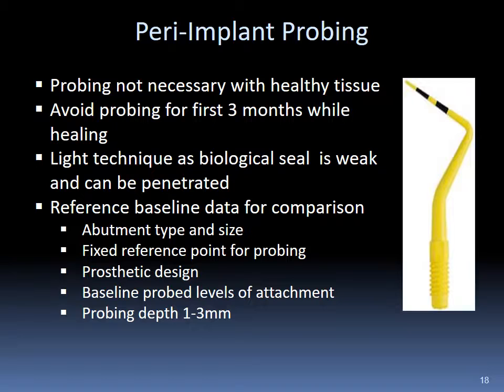Reference baseline data for comparison of healing and future restorative needs, such as abutment type, fixed reference points for probing depths, prosthetic design, baseline attachment levels, and probing depths from 1 to 3 mm are measurements used to assess and compare the health of the implant at your care visits. Light probing techniques should always be used.